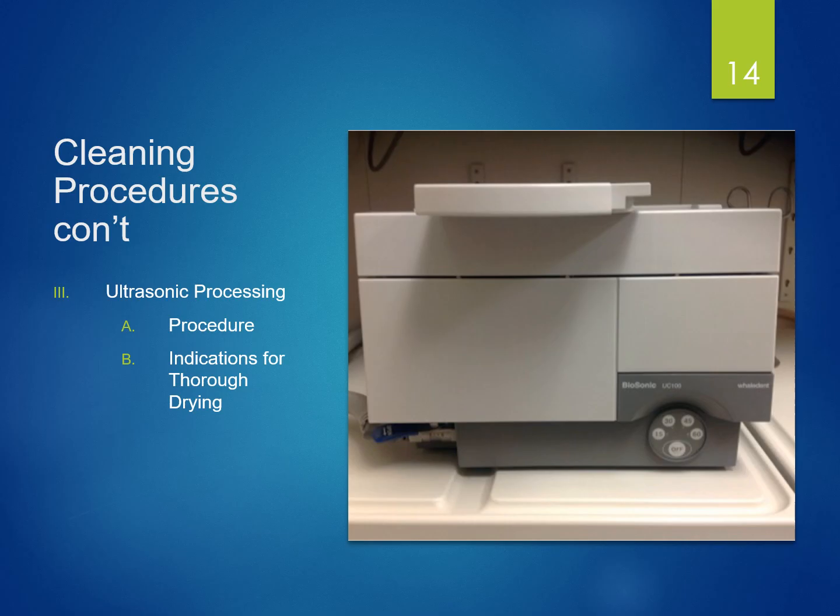This ultrasonic cleaning is done before sterilization, and it's much more safe than manual cleaning. Manual cleaning, if you're trying to scrub that instrument, is time consuming, and it can cause a potential for a sharps exposure, and we certainly don't want that. The ultrasonic is not a substitute for sterilization, but it is for cleaning.